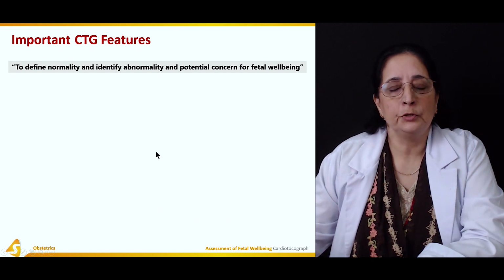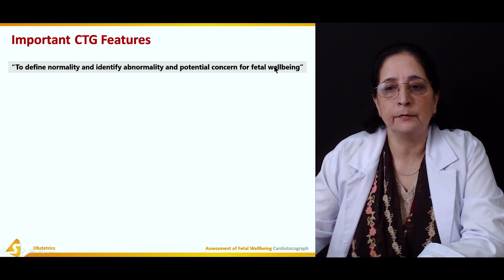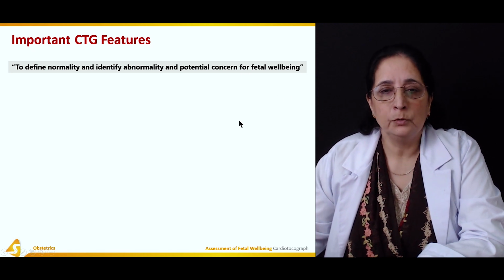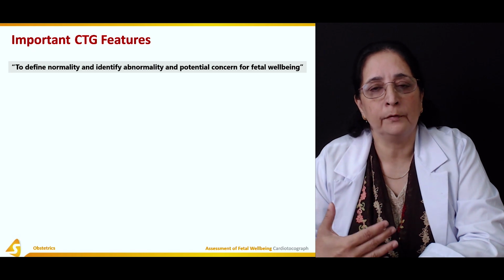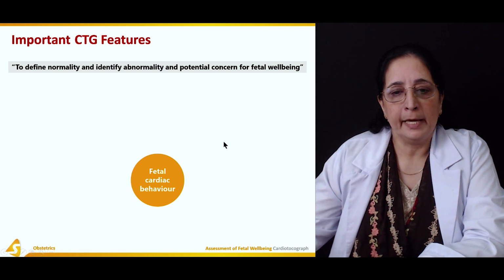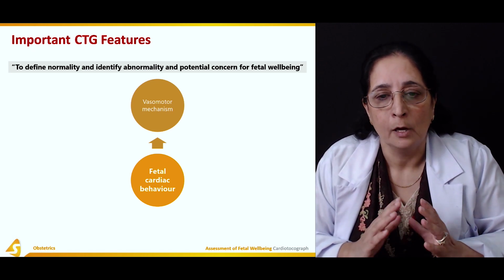Important cardiotocograph features to define normality and identify abnormality and potential concern for fetal well-being. So this is very important to identify any abnormality, and it tells whether the condition of the baby is good or not. Fetal cardiac behavior, we have three mechanisms that affect the fetal cardiac behavior.